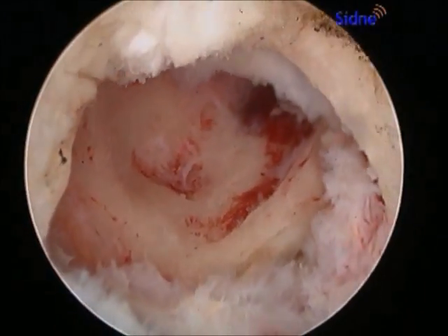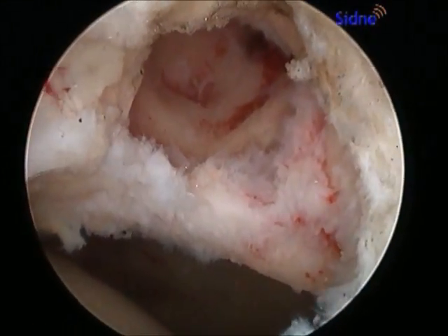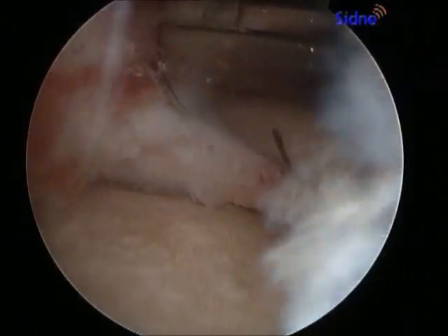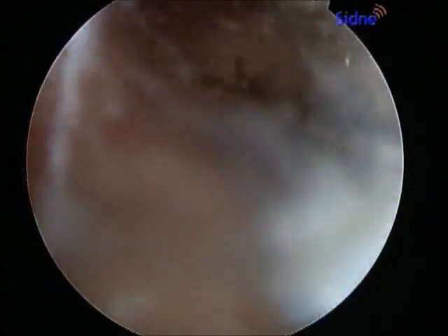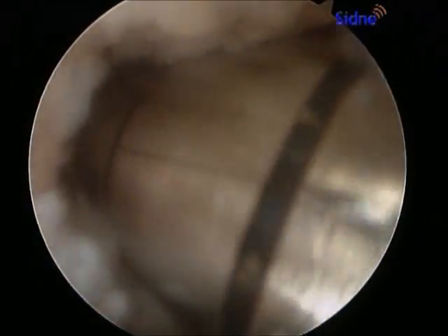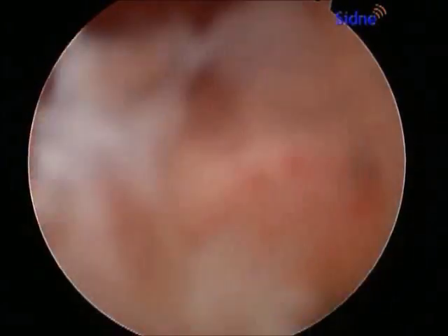This cavity can be bone grafted and the body will then heal in a new layer of bone. A slotted metal cannula full of bone graft chips is placed to the opening of the cyst and a plunger is being impacted, pushing the bone graft into the cyst. The bone graft becomes compressed in the cystic area and can then be pushed in further and compressed, impacting the graft.